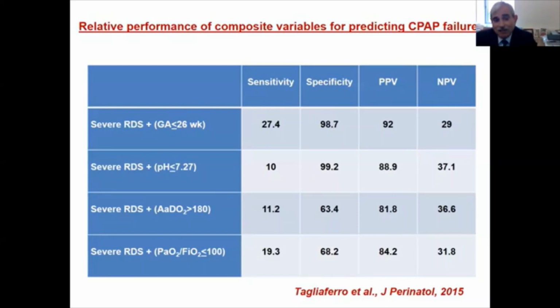But certainly, from what you said in the beginning of your talk, just keeping the airway protected, but not giving mechanical breaths and avoiding injury up front, you are probably not seeing those changes on X-ray that were classical in the past. That's what I would say.